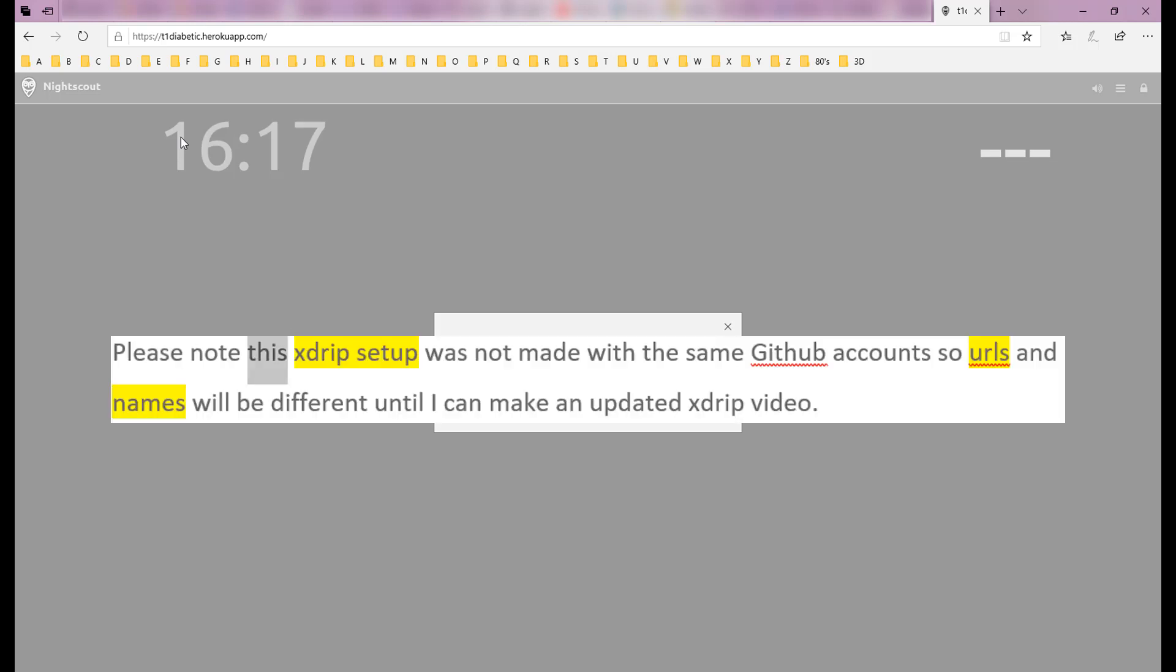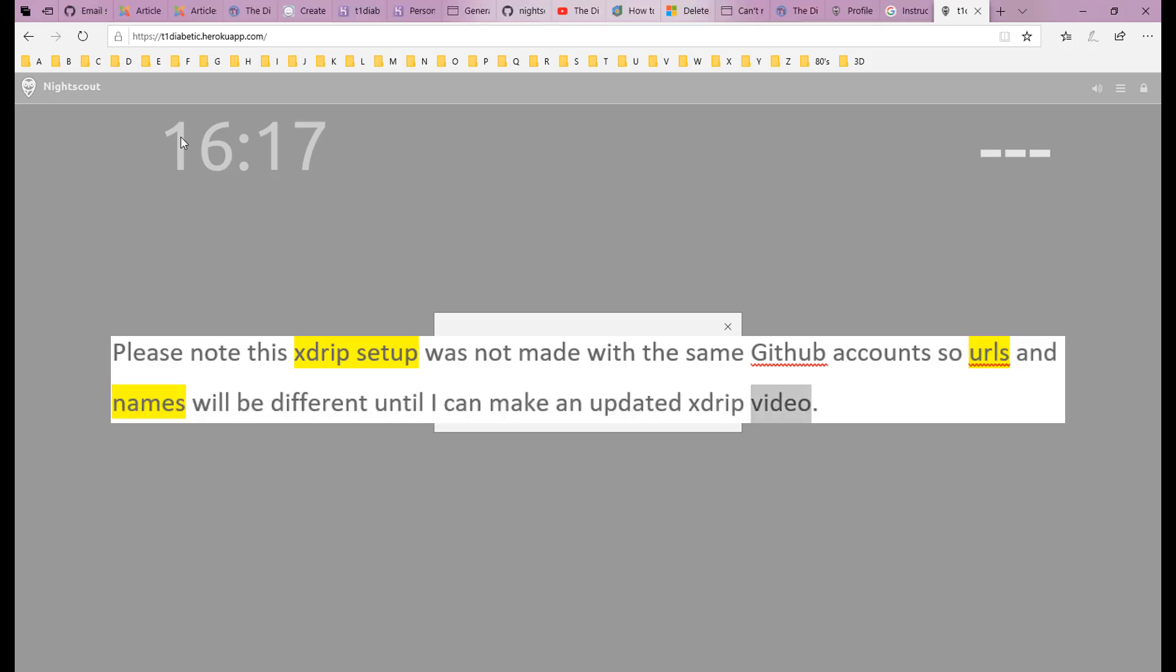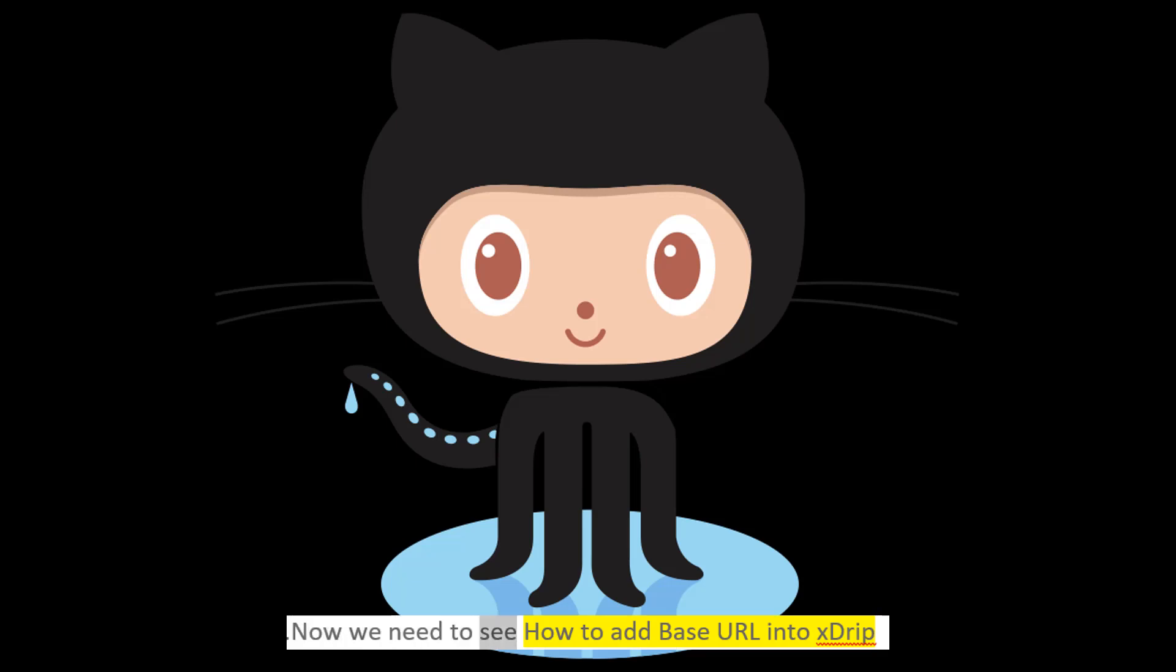Please note this xDrip setup was not made with the same GitHub accounts, so URLs and names will be different until I can make an updated xDrip video. Now we need to see how to add base URL into xDrip.